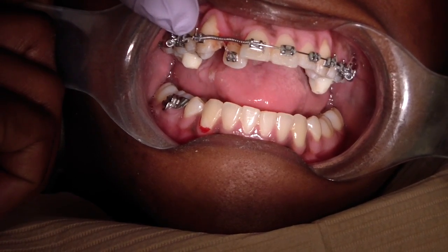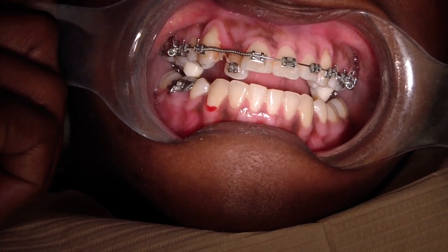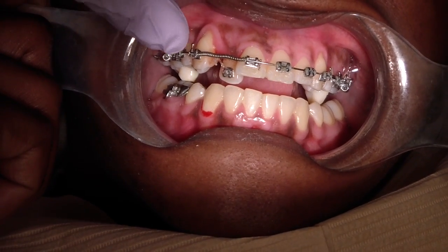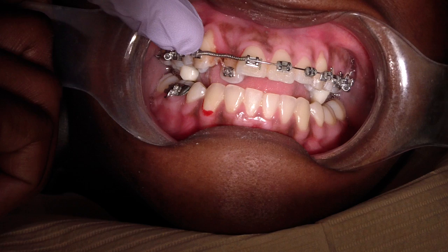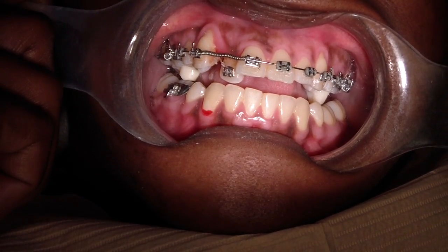Just bite down for me. We've also opened up her bite with some composite. She may ask for it to be done like that again. We're looking to — it won't take very long for that tooth to reposition itself out of crossbite, and she'll slowly wear down the composite.